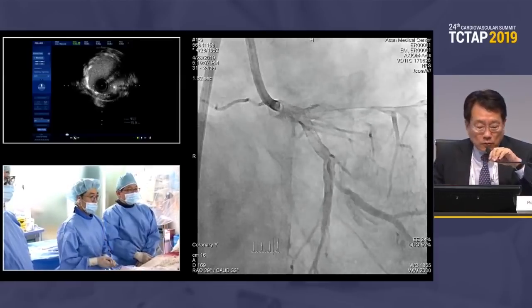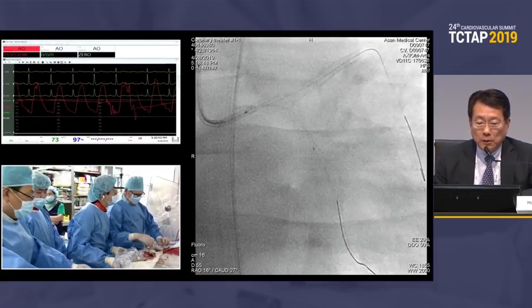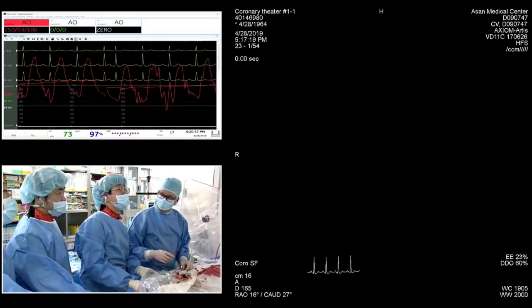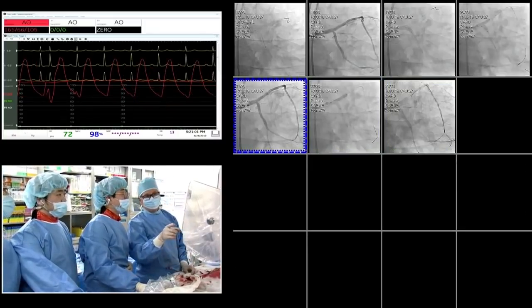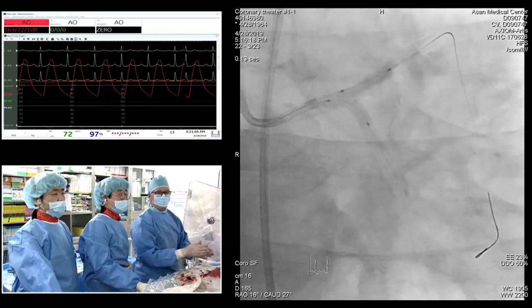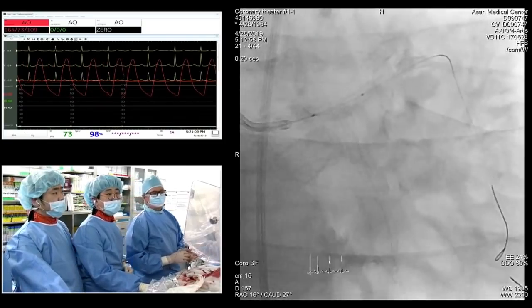All right, we're going to move to Dr. Lefevre. So we just discussed this, and maybe we can go back to what we have done. We have done the OCT in both branches. Yes, I will show you. Can we see the OCT findings, please?